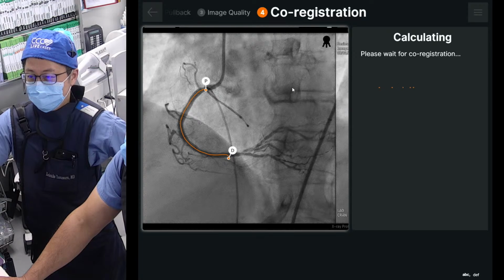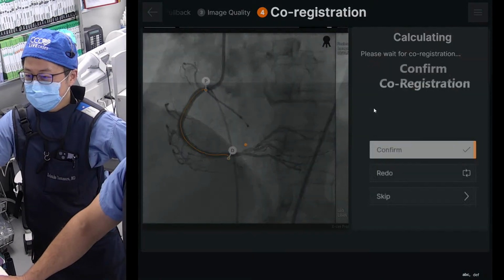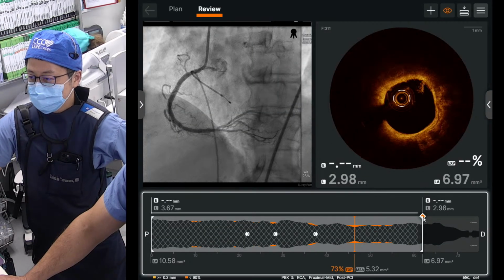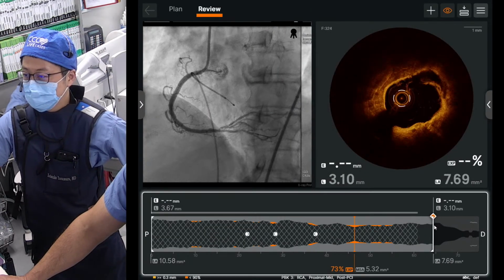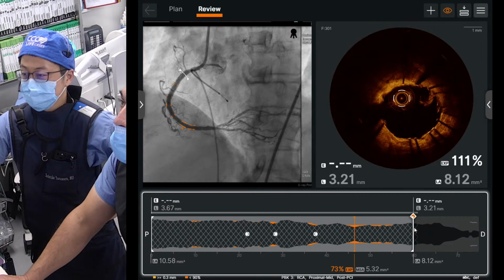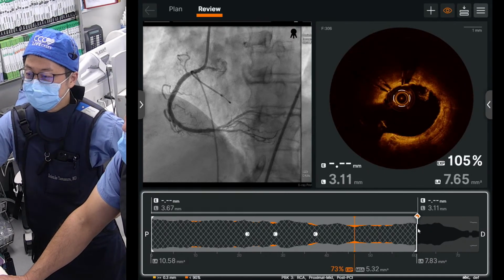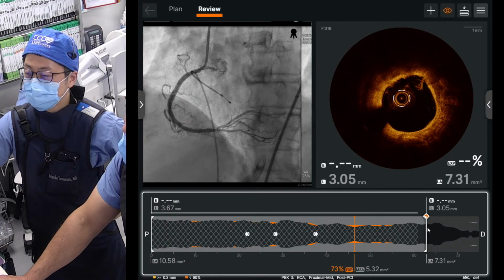Oh, finally. You could probably pull the pacemaker now. The AI learned it, so I show you that. From the distal native vessel, there is a smooth transition. I checked the distal edge in detail, where there is no malposition, no flap, no hematoma.